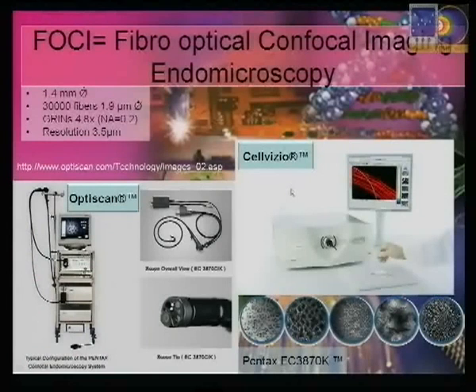There are two main fiber optical confocal systems right now in the market.